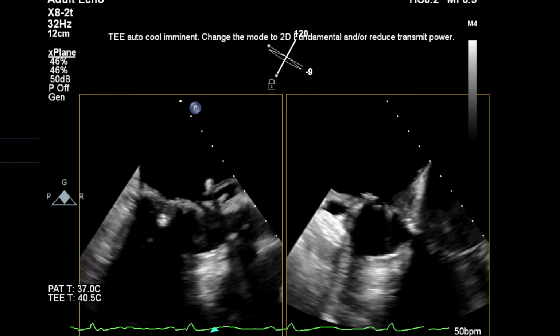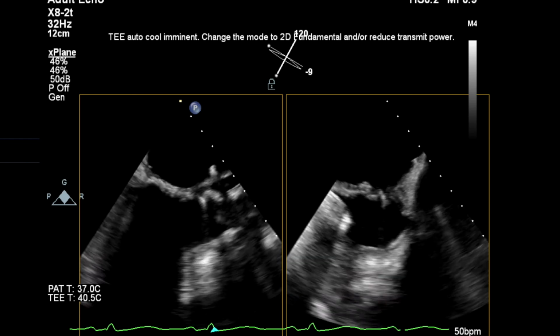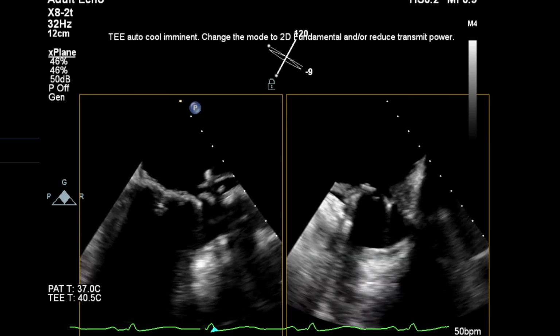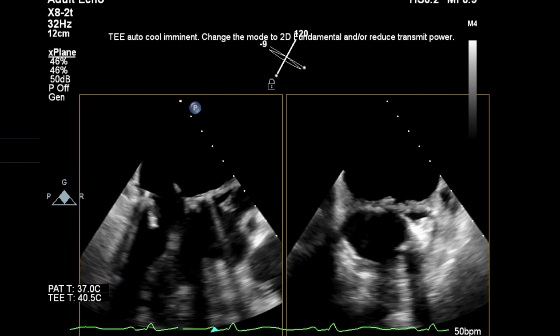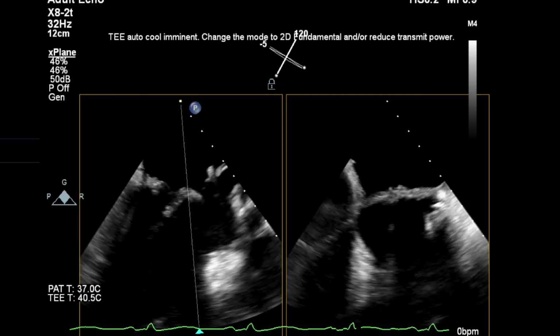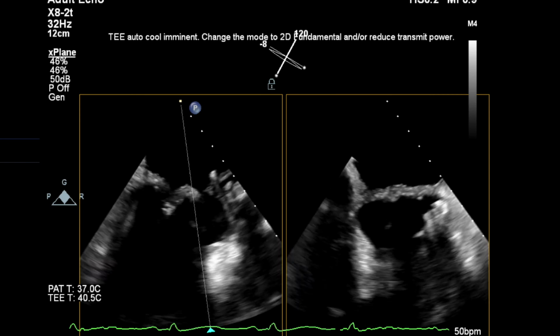Have you got both discs out? Yeah, look, both discs are out. That's because I was pushing forwards. Okay, so now we'll recapture one. What happened? I flipped it to the right way round. So we've recaptured one of the discs.